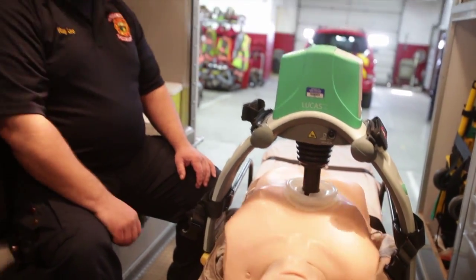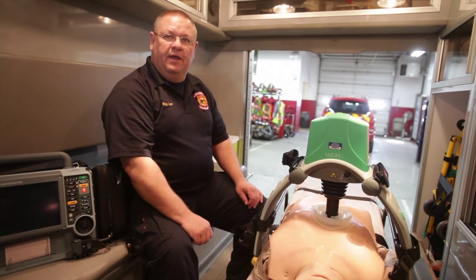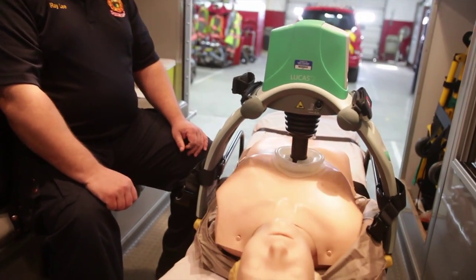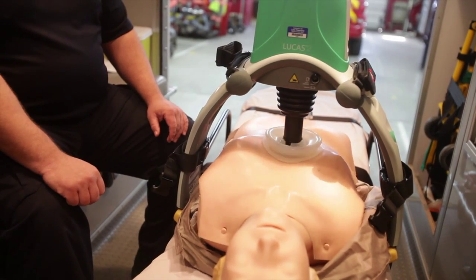It will keep this up until we either pause it or turn it off. But it's good, consistent — same depth, same rate — without a rescuer becoming tired and having to switch rescuers out. Right now the standard is to switch a rescuer out every two minutes from doing compressions. Now we don't have to worry about that.